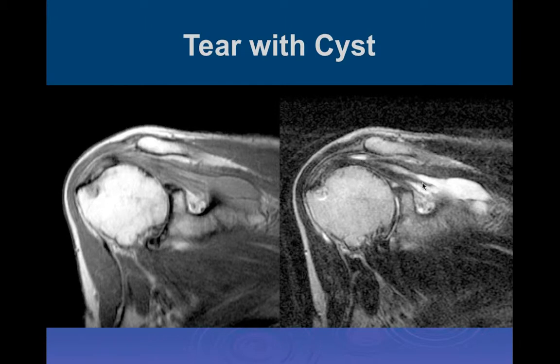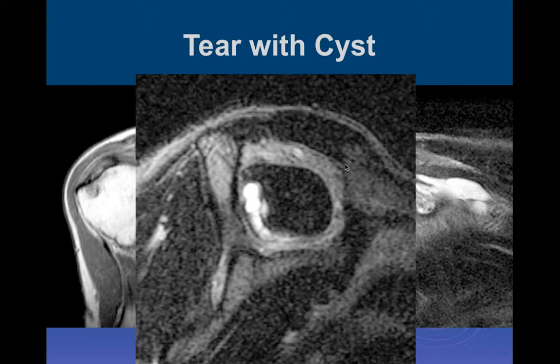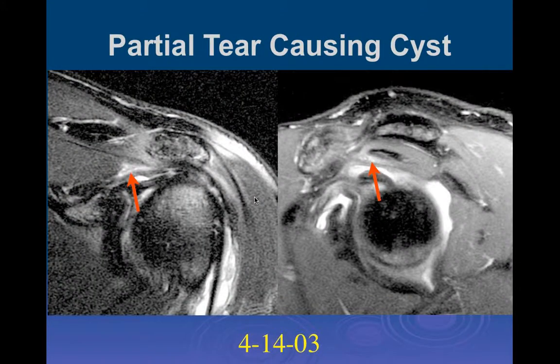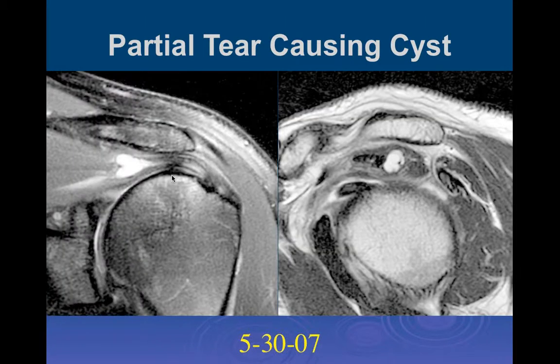Here's an interstitial tear again where we can see a proximal cyst develop within the muscle itself, a lot of distal tendinosis. On the fluid-sensitive images it was hard to follow the tear all the way into the joint space. Here's the cyst adjacent to the supraspinatus muscle. And then here's another partial tear going into the joint space on the inferior aspect of the supraspinatus tendon, and a heart-shaped cyst in the end of the muscle. You can see it on the sagittal images.